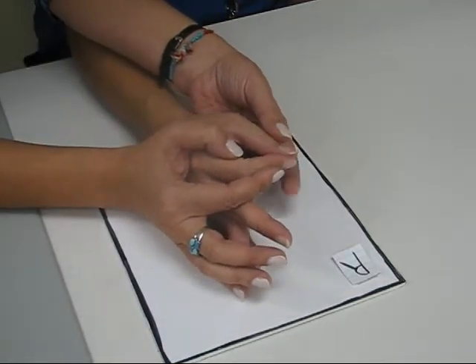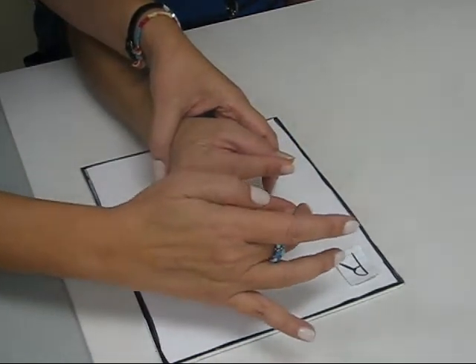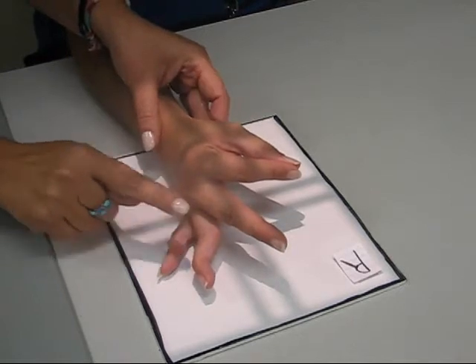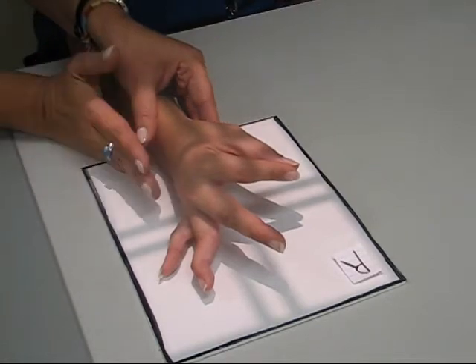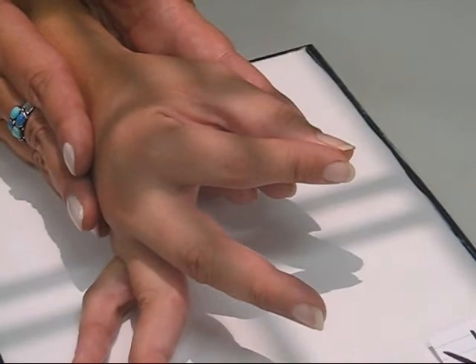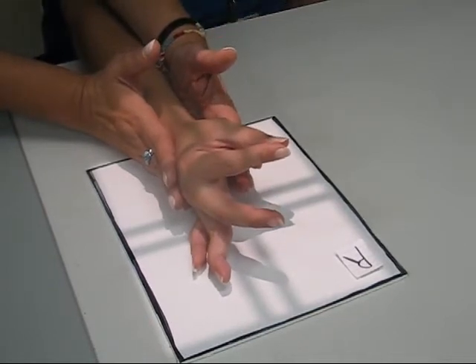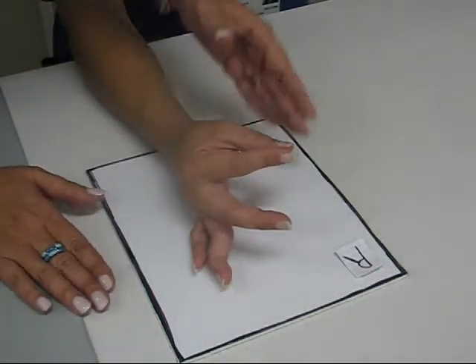join their thumb and their first digit, and then you're going to have them fan the digits around, and therefore you're going to get a lateral view of each finger separately. You have to make sure that the hand is still at a 90-degree angle with the cassette. So you want to make sure that their wrist per se is still in a lateral position. Okay, that would be it.